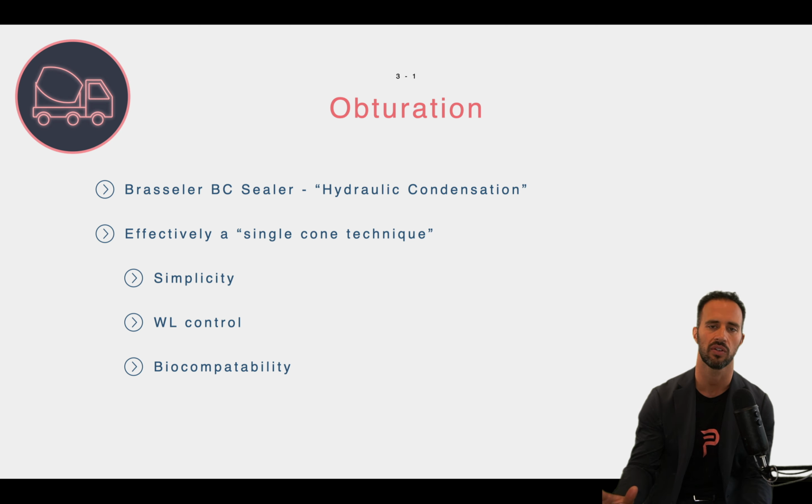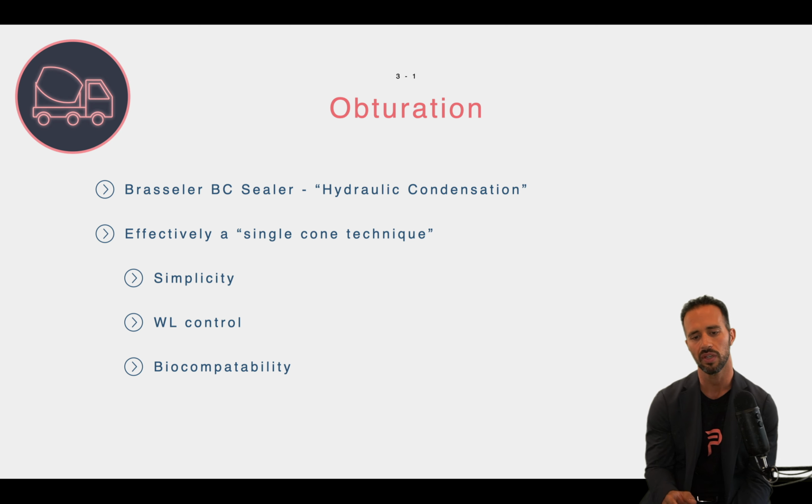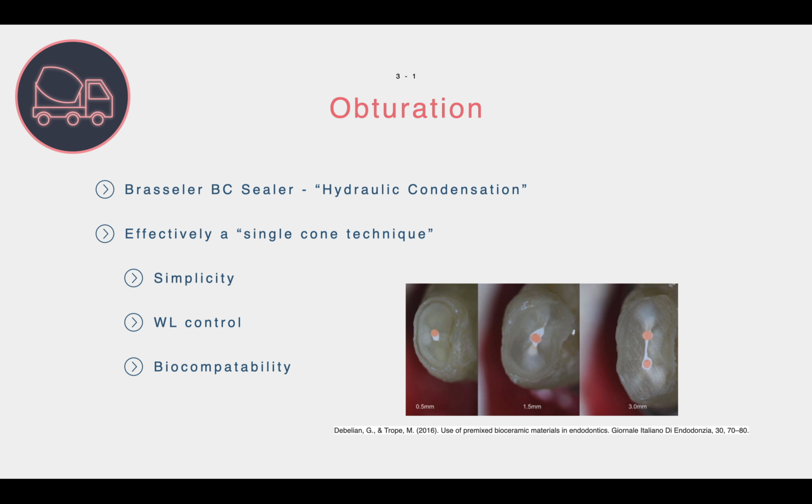And it's effectively a single cone technique. It's a fancy way of saying a single cone technique. The beauty of it is that the sealer has such amazing properties. It's essentially MTA-like chemistry and a calcium hydroxide-like chemistry. But it's very, very simple to do, the hydraulic condensation technique.